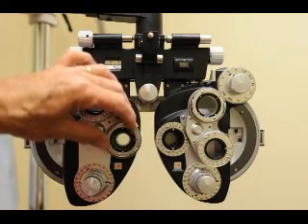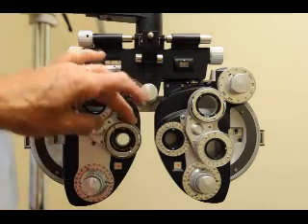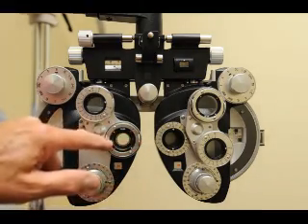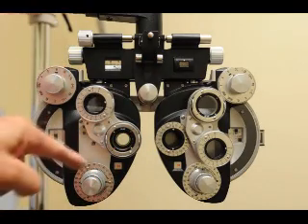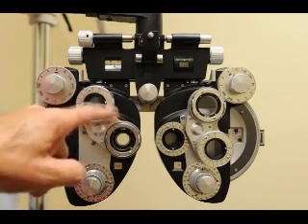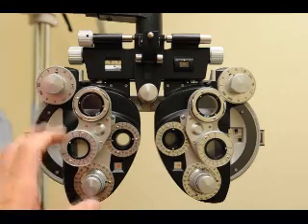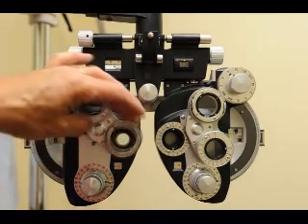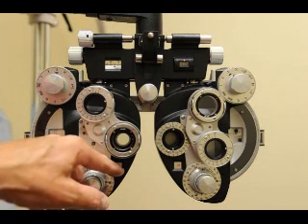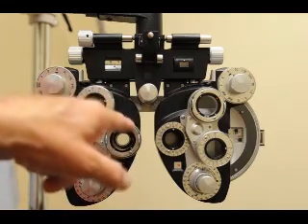Now for the cylinder: put the Jackson cross cylinder down and always start by checking the axis first. Line up the axis with the knurled rings here — straddle the axis line with the dots. Never touch the cylinder axis dial unless you have the Jackson cross cylinder in place. Always give the patient a choice with the cross cylinder — never fine-tune by just changing the cylinder dial directly, because the cross cylinder makes a quarter diopter difference look like a half diopter, giving the patient much better ability to distinguish.